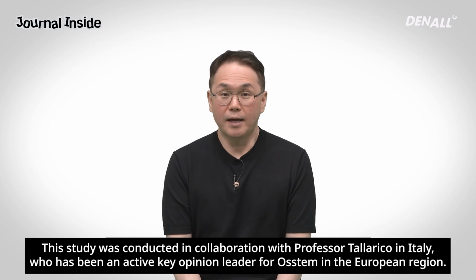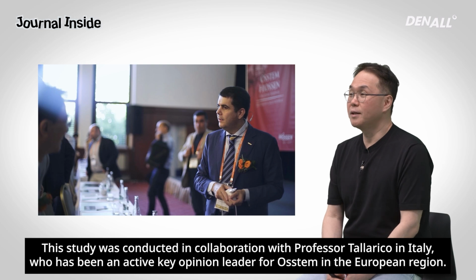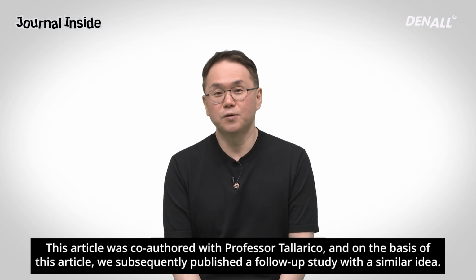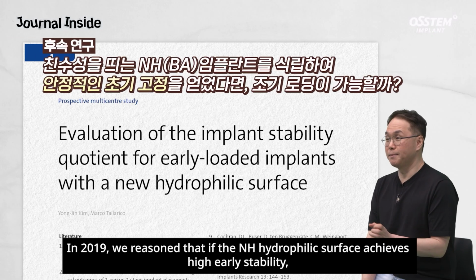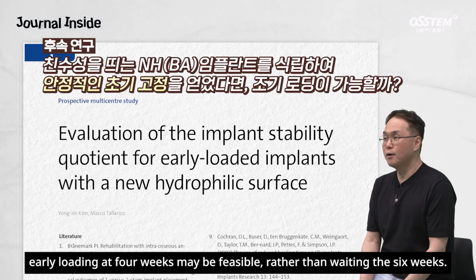This study was conducted in collaboration with Professor Tallarico in Italy, who has been an active key opinion leader for Osstem in the European region. This article was co-authored with Professor Tallarico, and on the basis of this article, we subsequently published a follow-up study with a similar idea. In 2019, we reasoned that if the NH hydrophilic surface achieves high early stability, early loading at 4 weeks may be feasible, rather than waiting the 6 weeks.